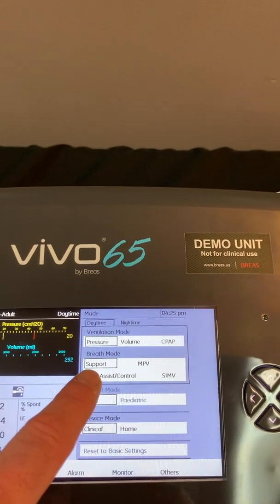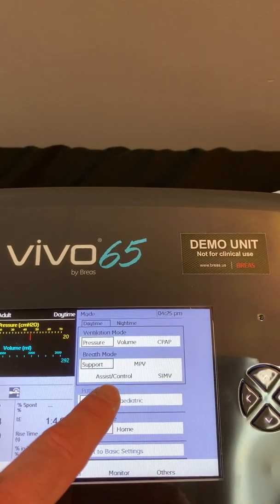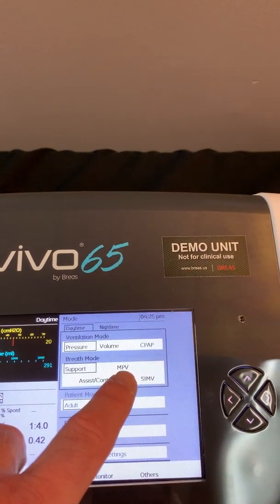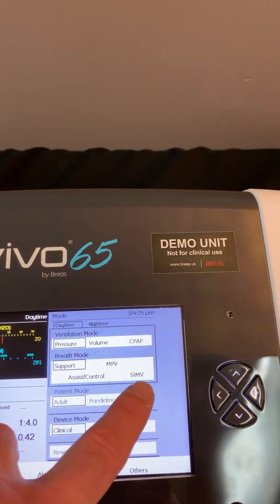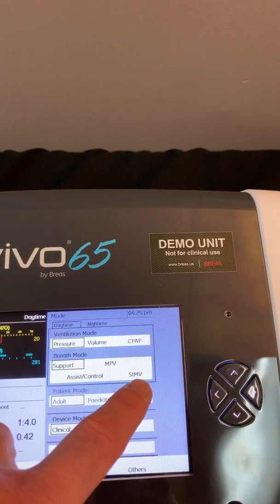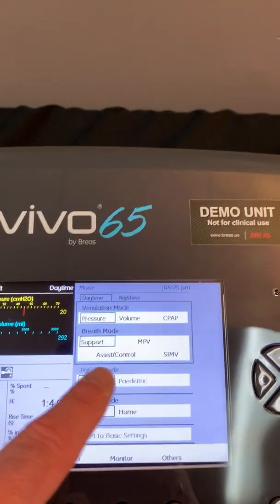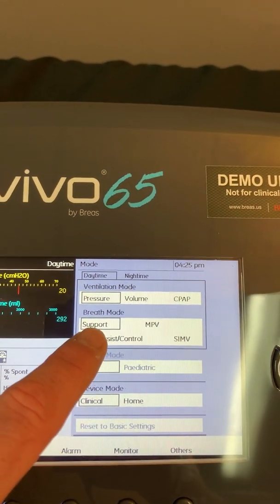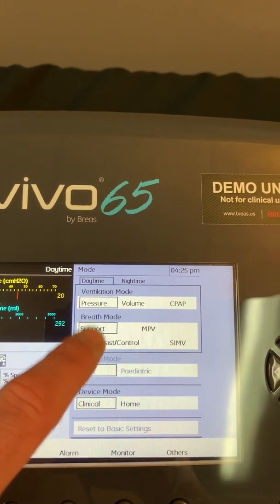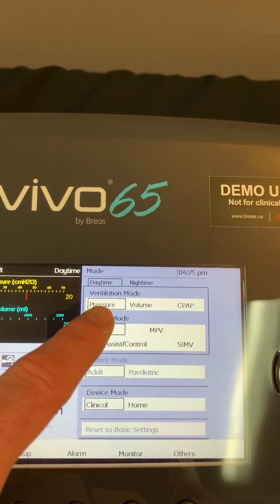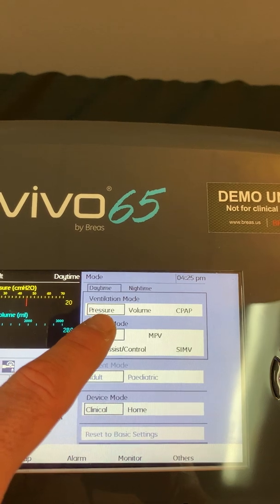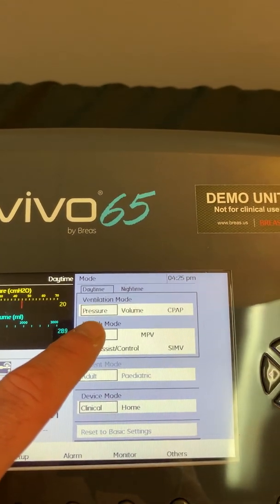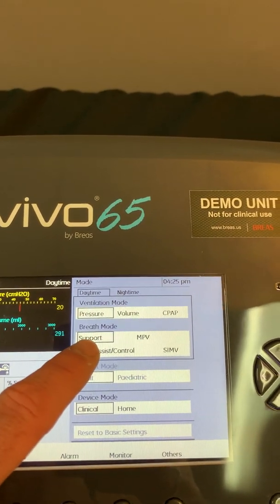Currently I have a choice for support, assist control, MPV — which stands for mouthpiece ventilation — as well as SIMV. Currently in my breath mode I have a box around support, so the mode of ventilation that the ventilator is in right now is pressure support.